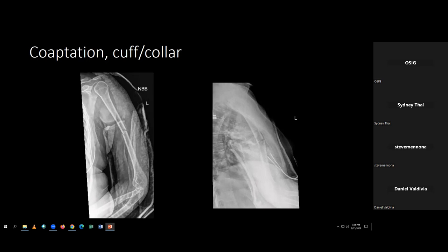But something like a humeral shaft fracture doesn't need to heal 100% anatomically. There are certain degrees, which I don't think is necessarily important for you to know at this point, that are acceptable. If you go over that threshold, it won't heal in a way that's functional for people, or will limit their functionality, and so we'll treat them operatively in that circumstance. But this one is minimally displaced. It's a little angulated, but definitely within an acceptable range, and it's not inside of a joint. So this will probably heal just fine.